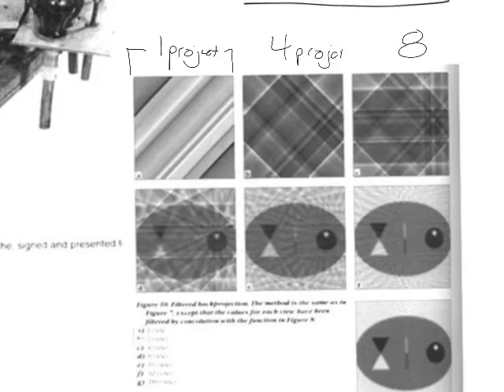We're not just interested in this one projection, or any one of these 4 projections, right? Or any one of these 8 projections. We're combining them all. We're letting the computer, an algorithm, combine them all. It's using a recipe to combine them all. So it does that over and over and over and over again. And the process that we call that, the fancy word for that, is filtered back projection.